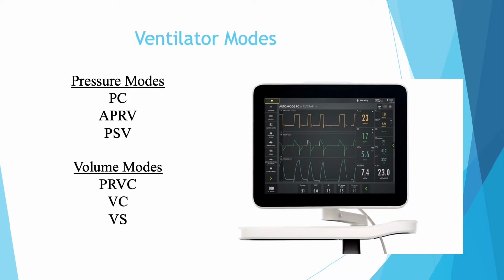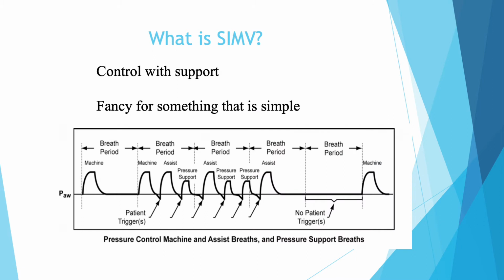These values are something you set on the ventilator, not to be mistaken with last module where you're setting the numerical values. These are mode values, and they'll have different dynamic features in them that you will be setting. Once you understand if you're running a pressure mode versus a volume mode, the next thing to look at is, are you running a control or a support mode?